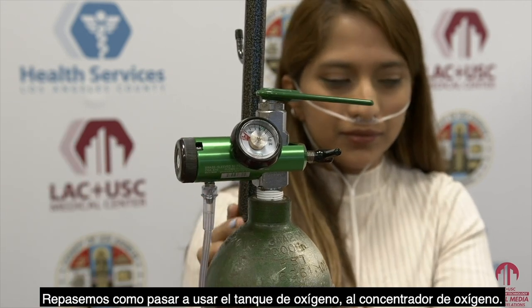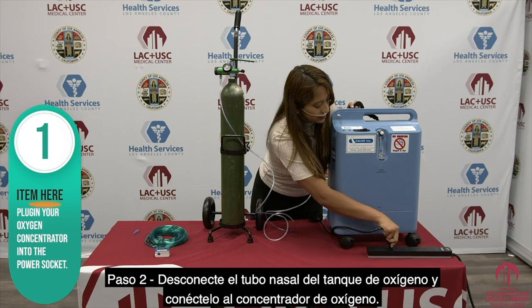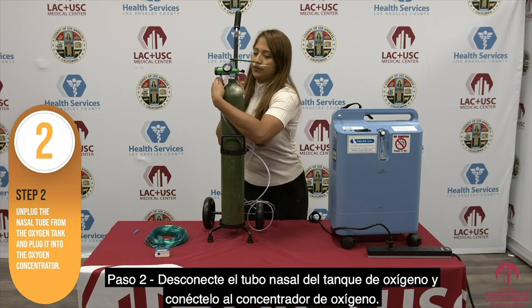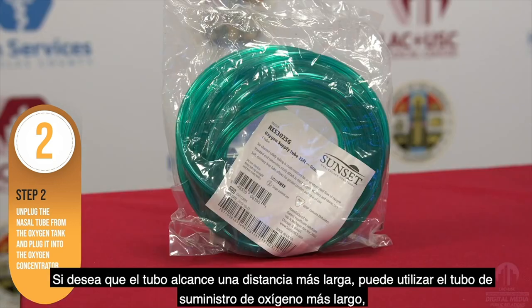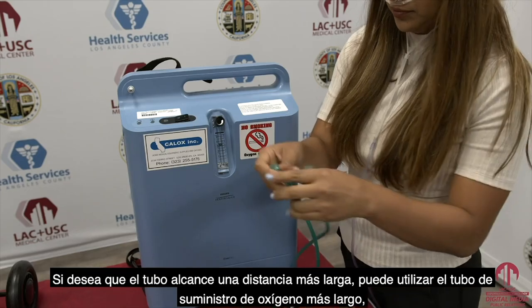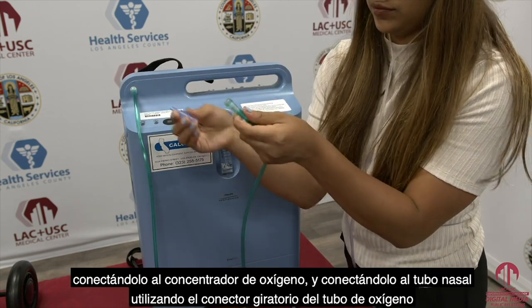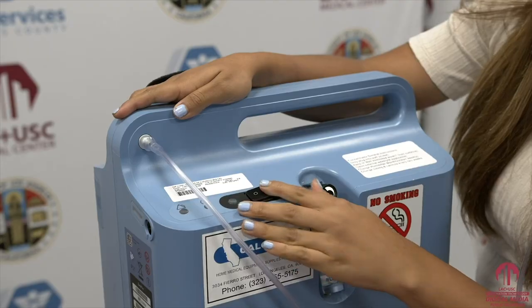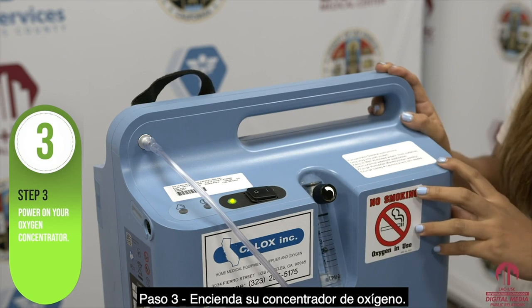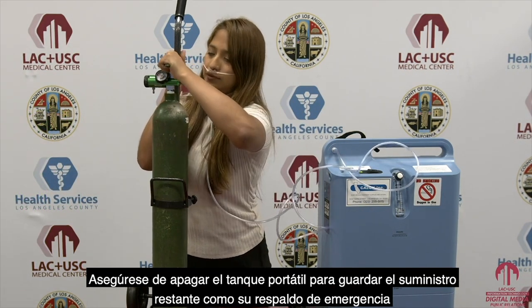Let's go over how to transition from using your oxygen tank to your oxygen concentrator. Step one: plug in your oxygen concentrator into a power source. Step two: unplug the nasal tube from the tank and connect it to the oxygen concentrator. If you would like the tube to reach a longer distance, you may use the longer oxygen supply tube by connecting it to the oxygen concentrator and to the nasal tube using the oxygen tubing swivel connector. Step three: power on your oxygen concentrator. Be sure to turn off your portable tank to save the remaining supply as your emergency backup.